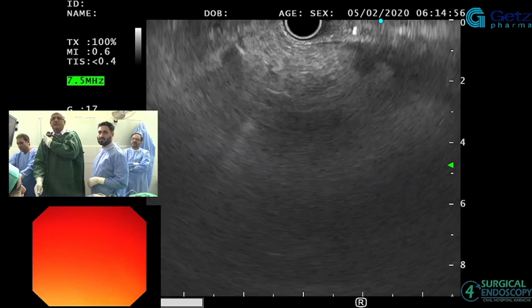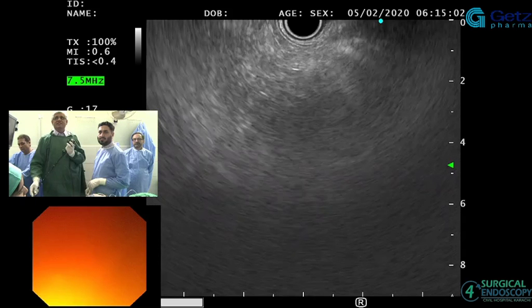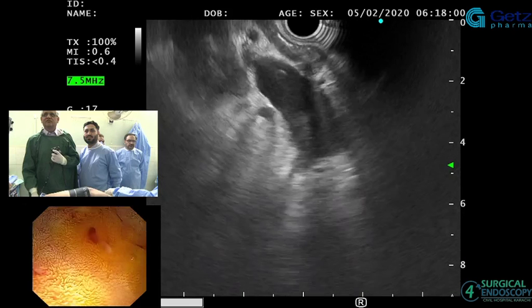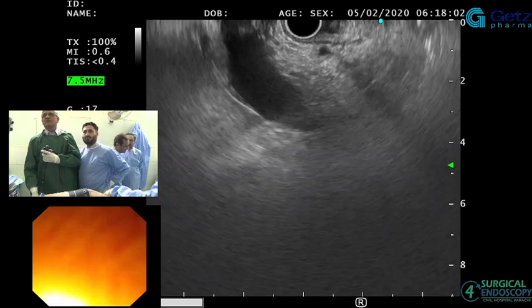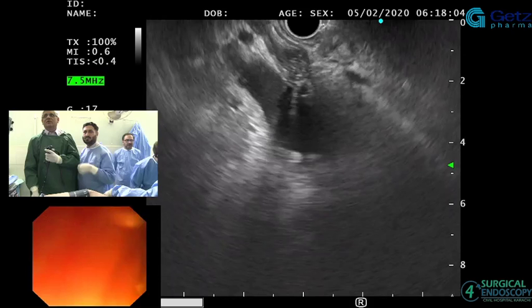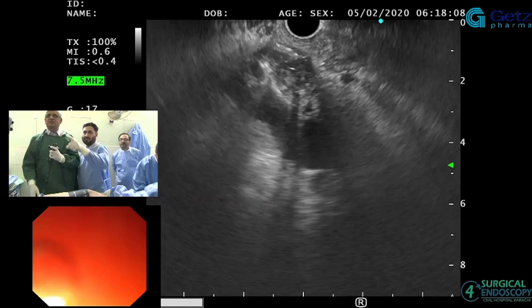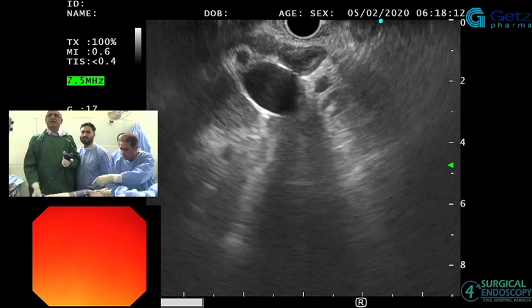Okay? This is a big subject, so sometimes you can't see things as clearly, and you just saw the adrenal as well. Our area of interest here is D1. So let's go to D1. So that's the reason. So you need to just check. As soon as we are in the right place, there's your portal vein. That's your CBD. You can see the CBD with debris here.